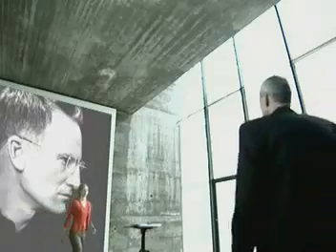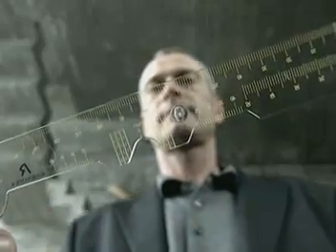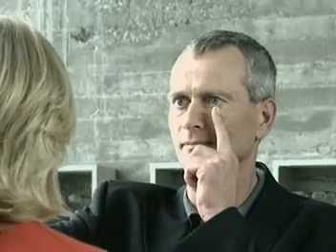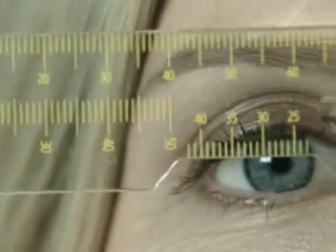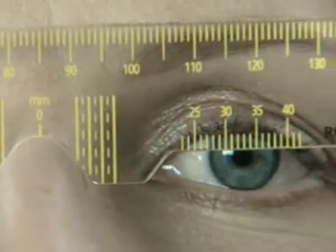The monocular interpupillary distance is often measured with a PD meter or a video fitting system. The combination tool, however, can also be used to measure the PD simply and quickly. Just place the tool at the root of the nose and instruct the patient to focus alternately on your left and right eye in order to exclude any possibility of incorrect measurement due to convergence. Read off the value at the point the scale intersects the pupil center for both eyes separately.